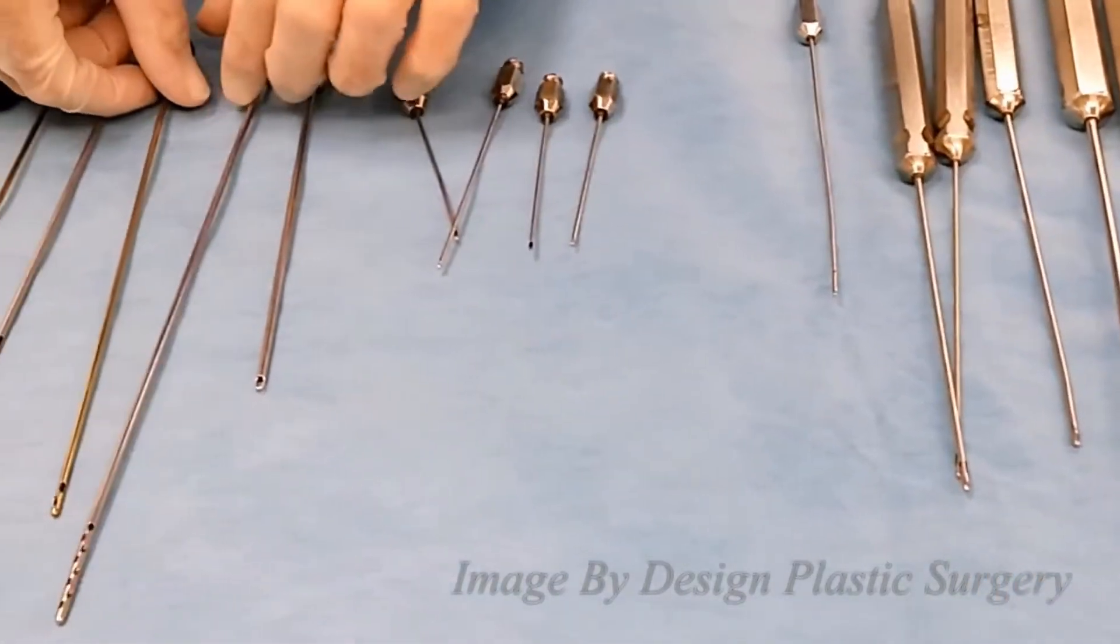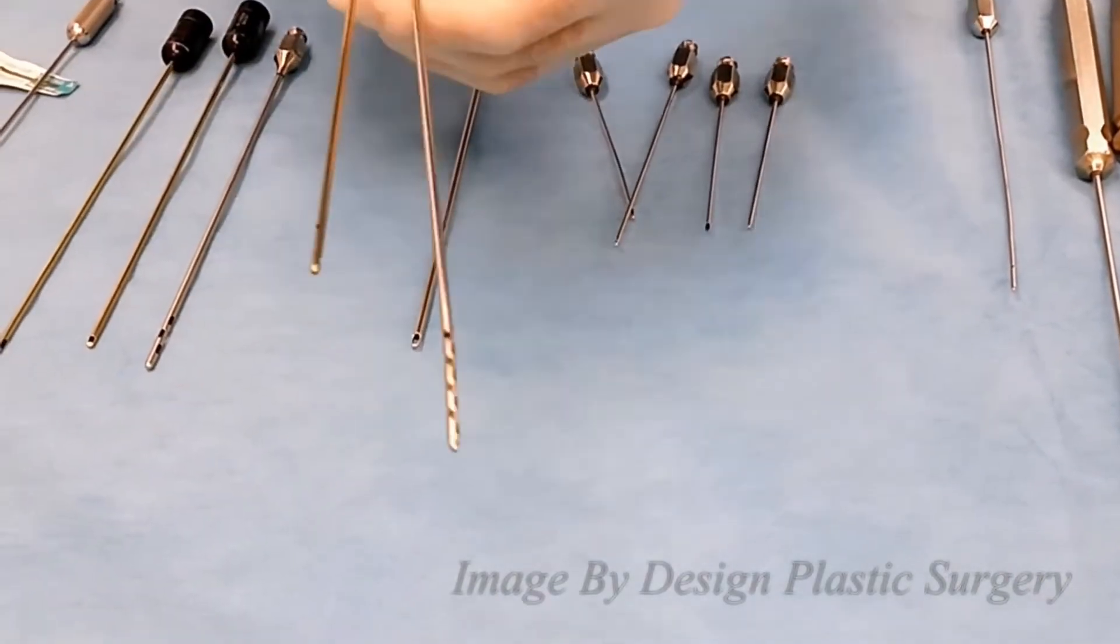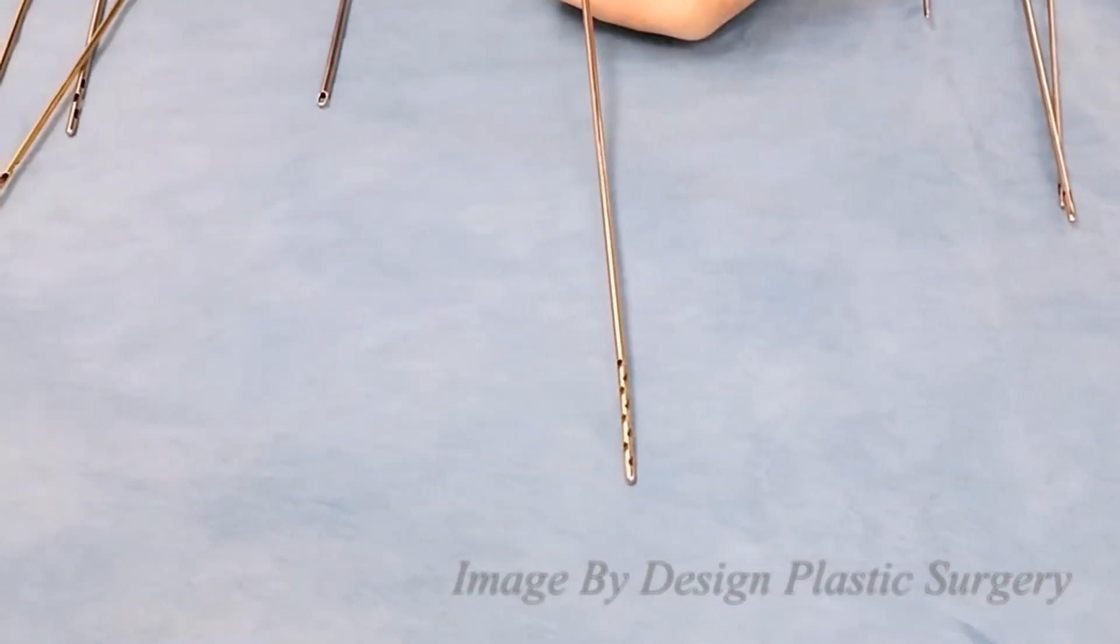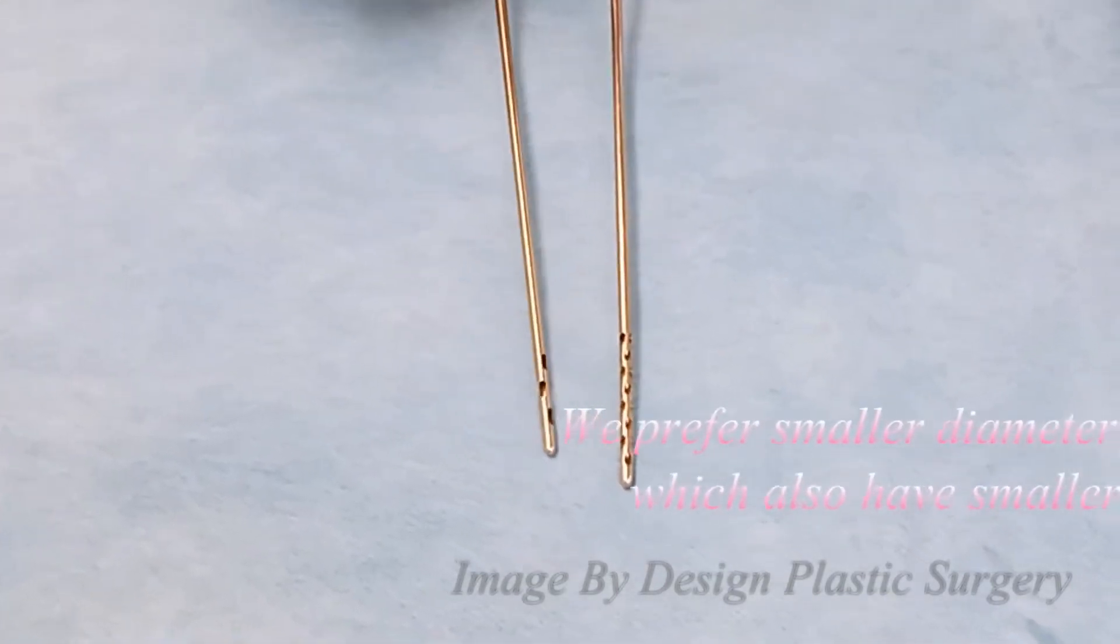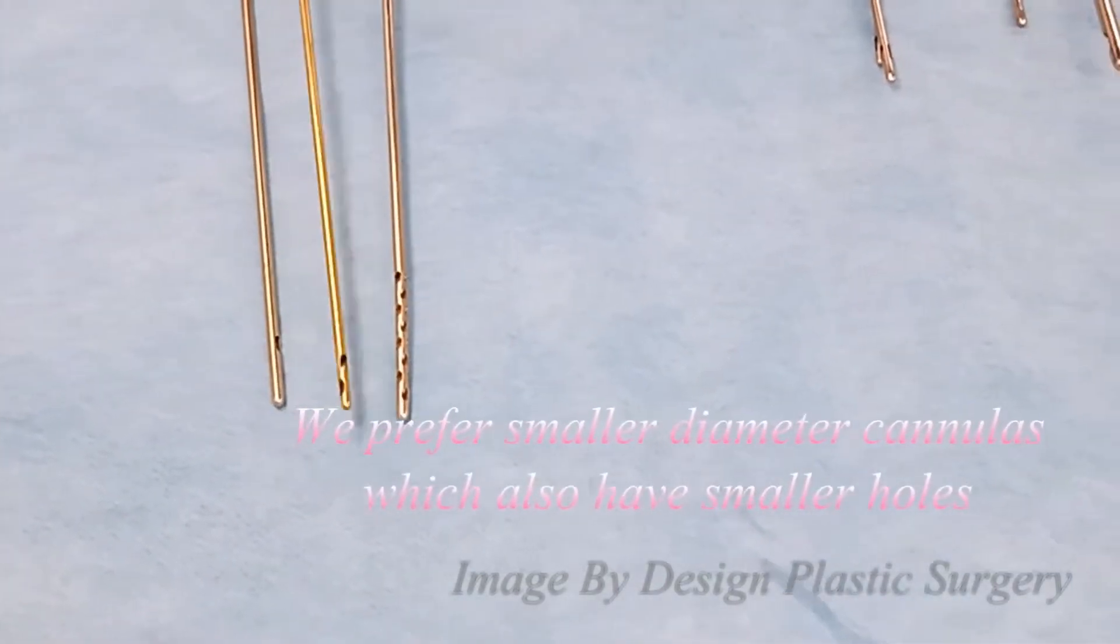And then you can see the difference with the harvest cannulas for fat. These have, you can see, multiple holes. This helps to increase the amount of fat that we're removing.